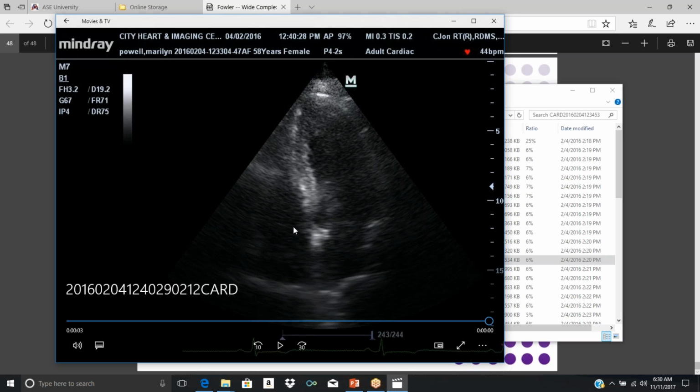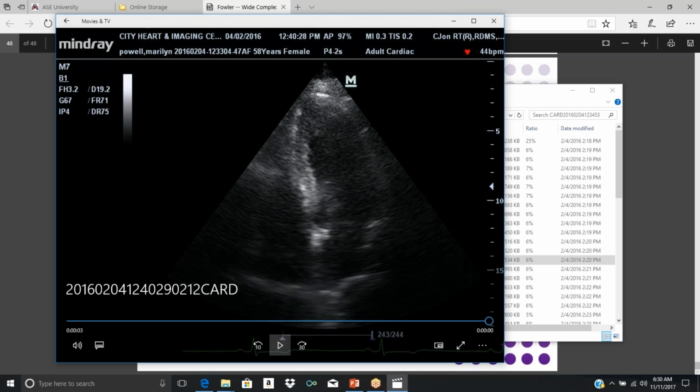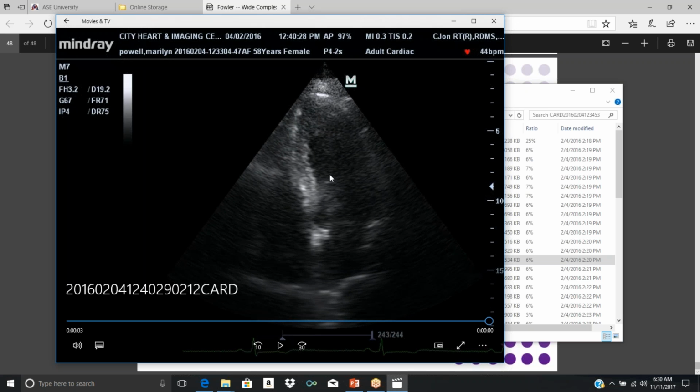Okay, so this is the septal leaflet, and the anterior leaflet of the tricuspid valve is right there. RV cavity. Okay. So if you just eyeball this image, you can see that the contractility is very decent. If you put something in the center, you see the walls almost coming and touching your pointer. So that is a normal LV systolic function.